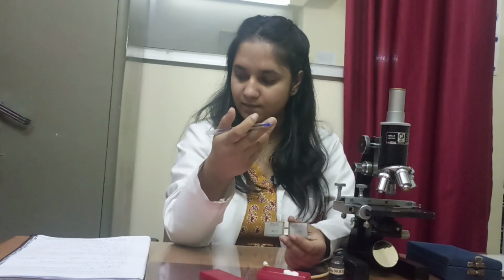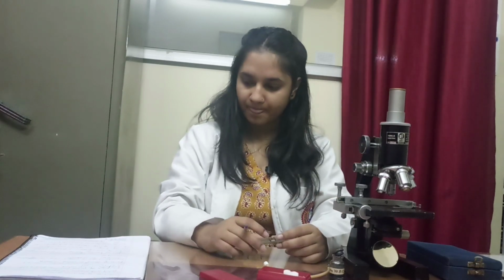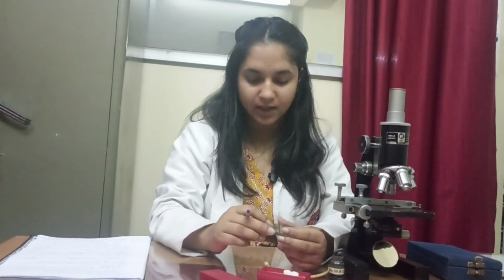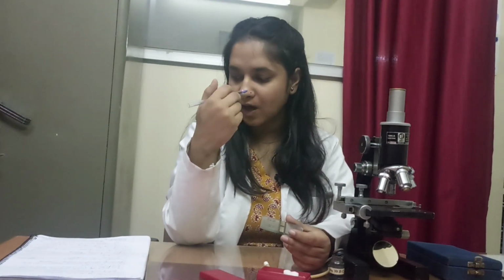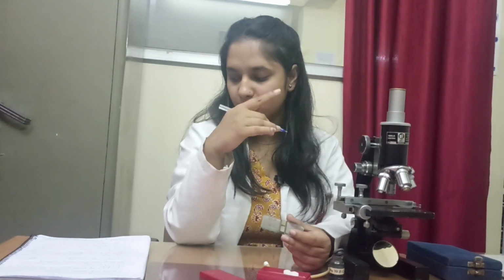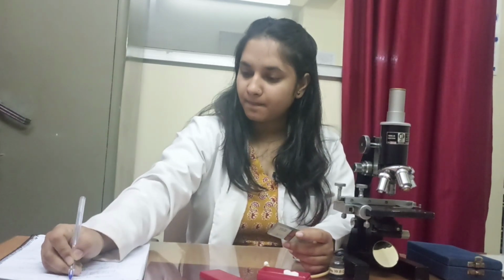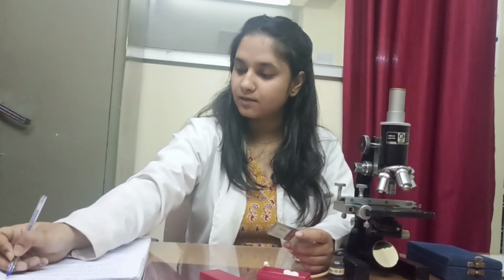in this way we should calculate the volume of 4 squares also. 4 into 0.1 is equal to 0.4 cubic mm. Okay. If the number of cells counted in 4 squares is n, then 0.4 cubic mm of blood will count n. So the number of cells, dilution factor of the blood, 1 cubic mm of blood will be, dilution factor is 20 times, and 1 cubic mm of blood has n into 50 cells.